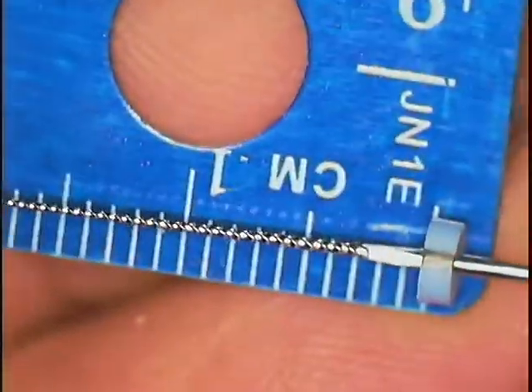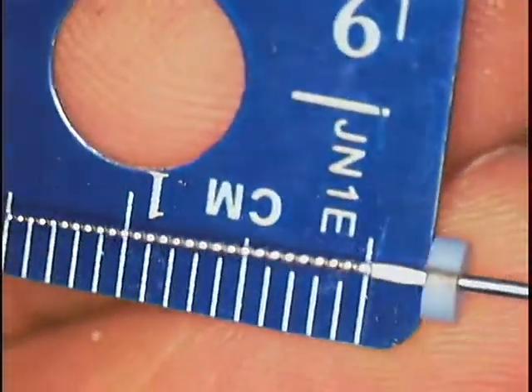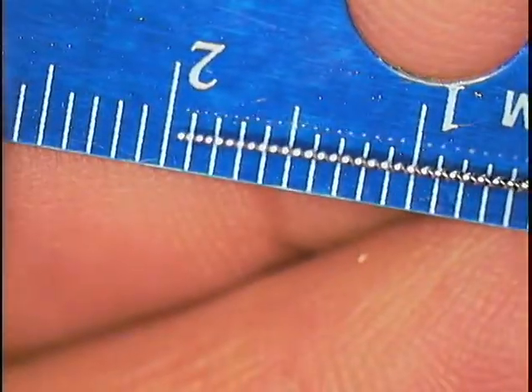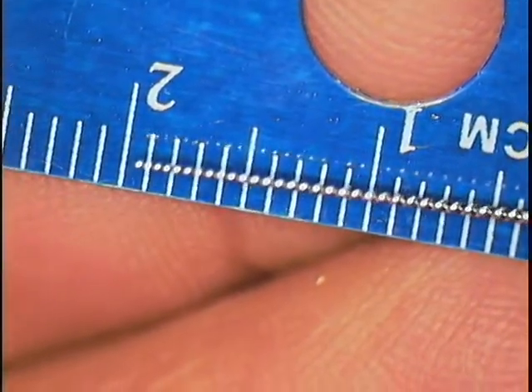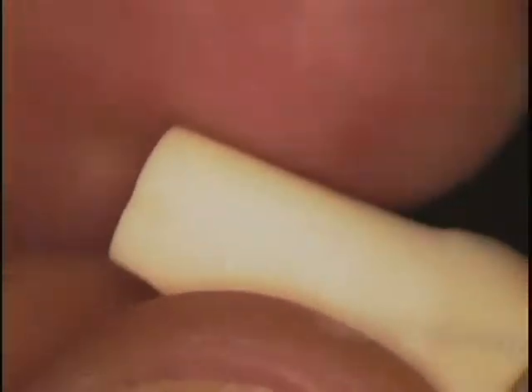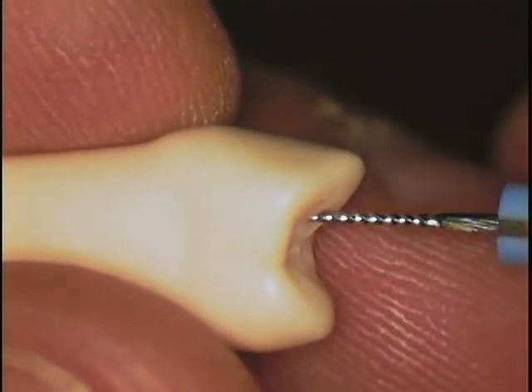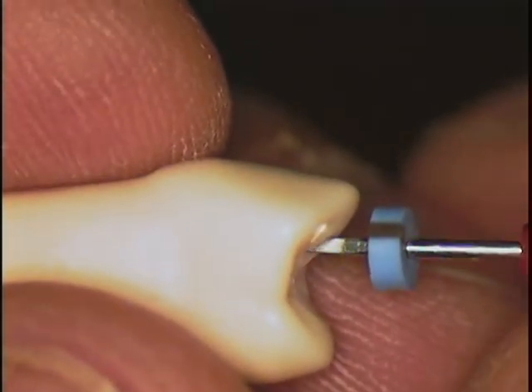Our typodont teeth are a little bit larger, or maybe they're on a younger patient whose apex didn't close all the way. Maybe we have to create that. Sometimes on a pediatric patient, they have an early root canal where you have to close the apex, and what they'll do is pack the apex with calcium hydroxide, and under natural causes, the apex will close with the stimulation coming from the calcium hydroxide.